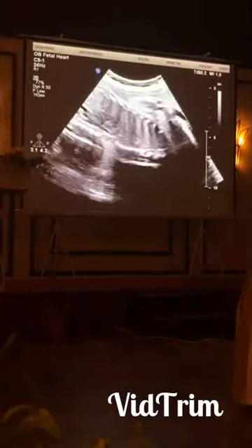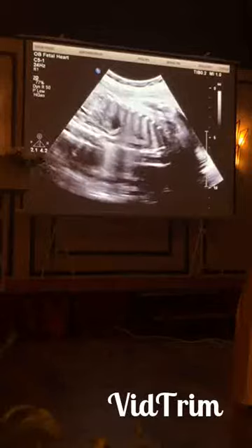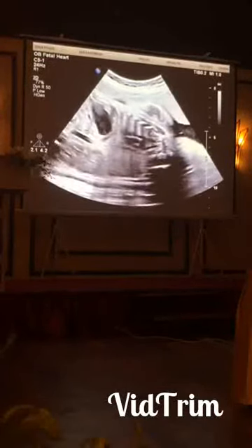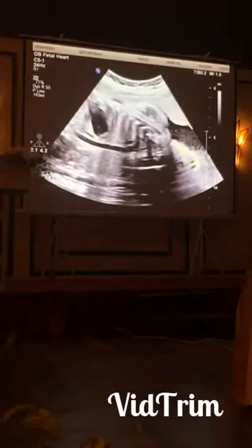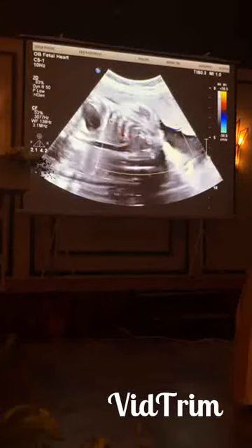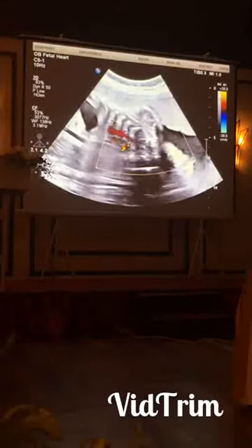Yeah, but you know, a while ago you could see the isthmus quite well. In this kind of view, right? You can see where the isthmus is, and you can see that it's rather smaller than the duct in this kind of view.